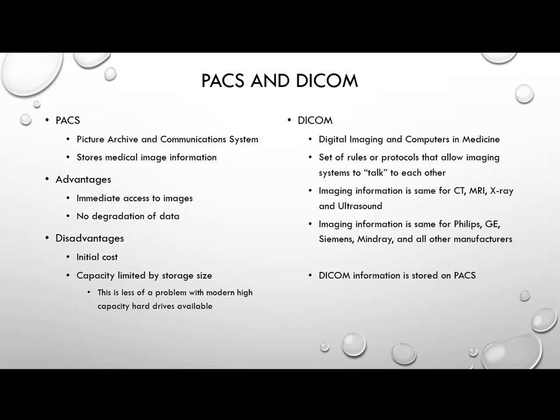But the other disadvantage is that the capacity is limited by the storage size. However, with modern hard drive capacities, this is much less of a problem. I think I just saw a 16 terabyte hard drive for $200 the other day. That's an incredible amount of storage. No reason why anyone can't afford that. I should say anybody with a PACS system.